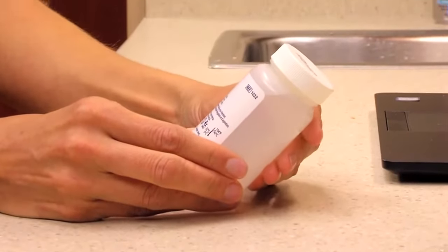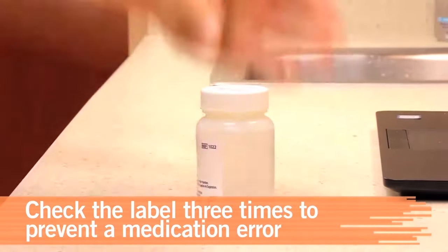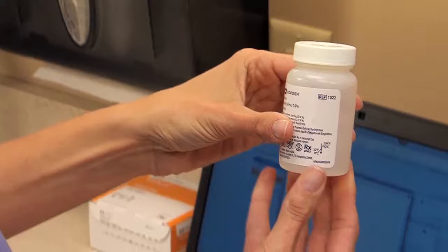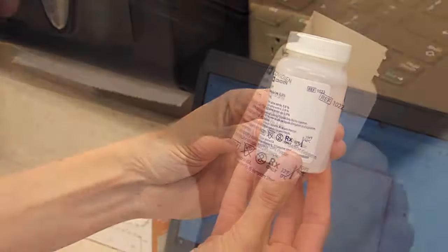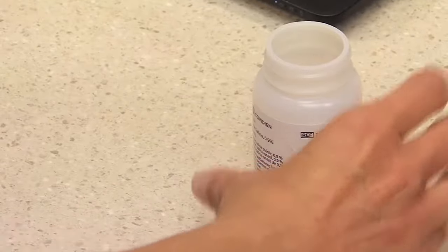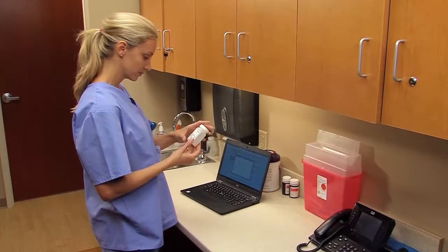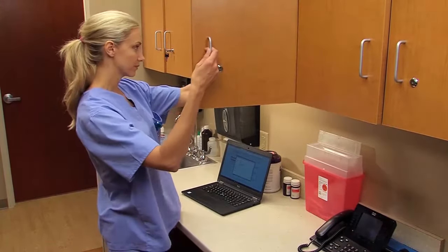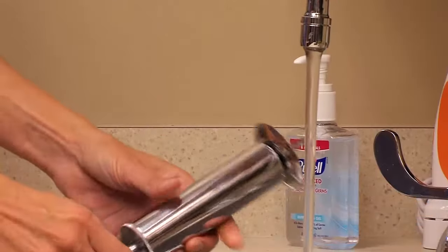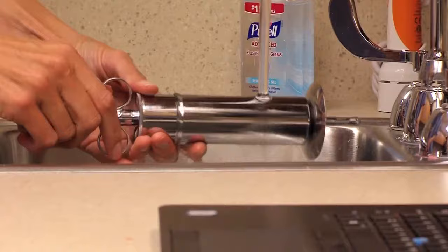To prevent a medication error, it's important to check the label of the solution three times. First, check the label when you remove the solution from the shelf. Check the label a second time as you pour the solution into the applicator. Check it a third time when you return the solution to the shelf. Prepare the solution as ordered.